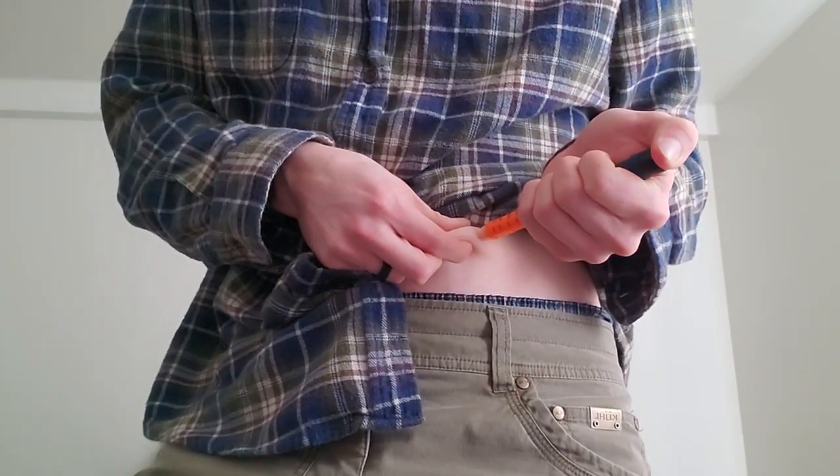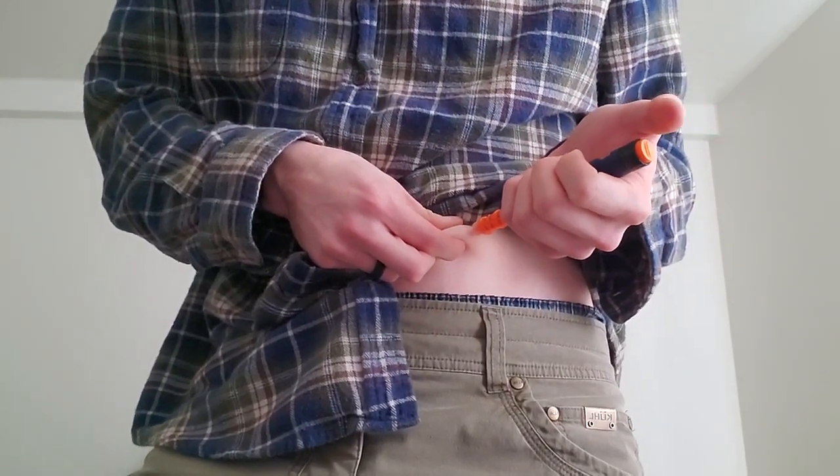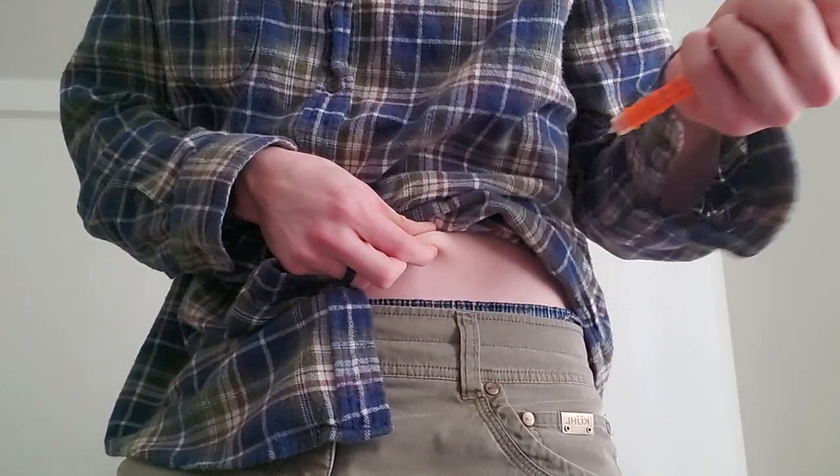Put in the insulin. Make sure it's all inserted before you pull it out. Don't pull out the needle until the button's all the way down, and then you pull it out. If you press the button as you're pulling out, it's not all going to insert. It's going to get on the outside layer of skin. It's not going to go through your body like it's supposed to, right? So now that's done. Good job.